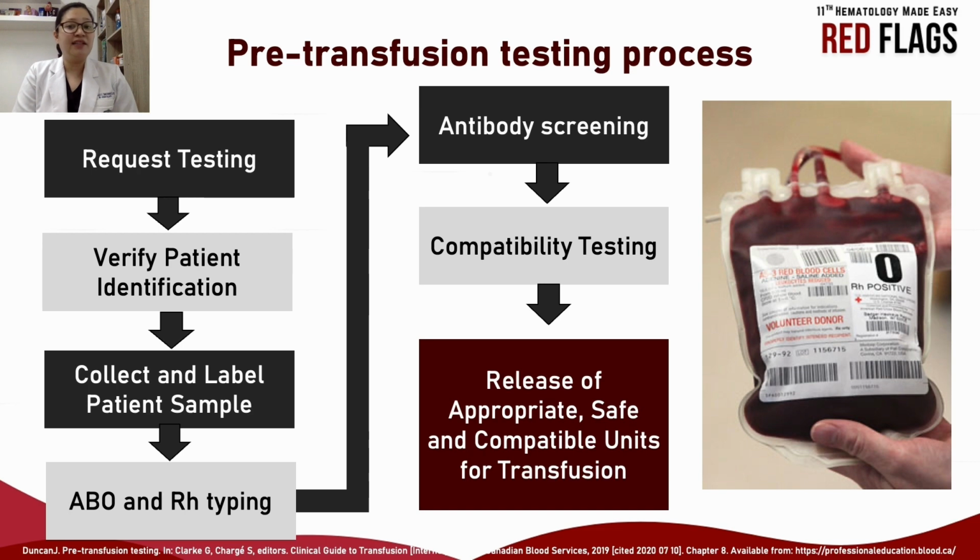Samples must be labeled in the presence of the patient at the time of collection with the patient's full name and a unique hospital identification number. Also document date and time of sample collection and phlebotomist's name.